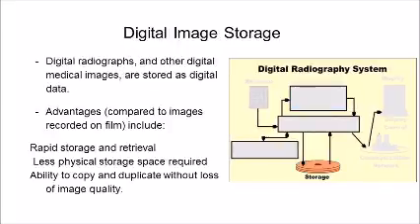Digital radiographs and other digital medical images are stored as digital data. Advantages compared to images recorded on film include rapid storage and retrieval, less physical storage space required, and the ability to copy and duplicate without loss of image quality.